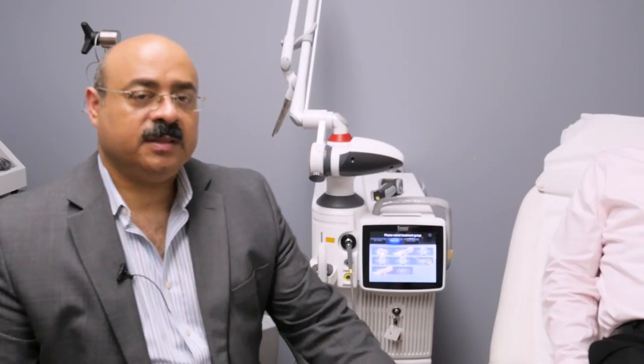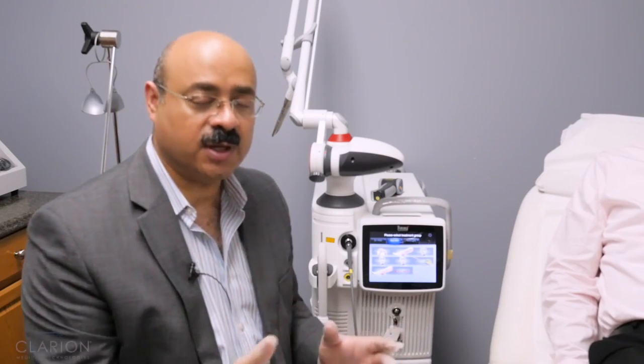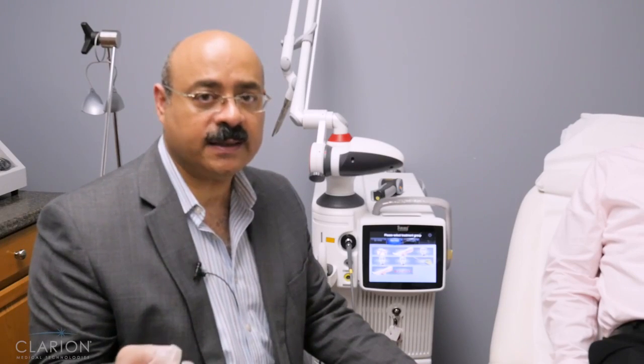We are going to be demonstrating some podiatry treatments — treatment of warts and treatment of onychomycosis. The treatment of pain demonstrated is also applicable in plantar fasciitis, where deep tissue heating is going to alleviate and improve the pain. Podiatric practitioners can use this device for plantar fasciitis, plantar warts, and onychomycosis.